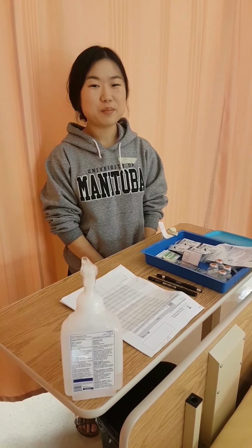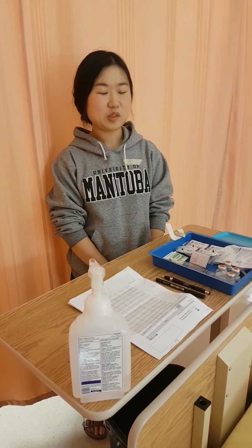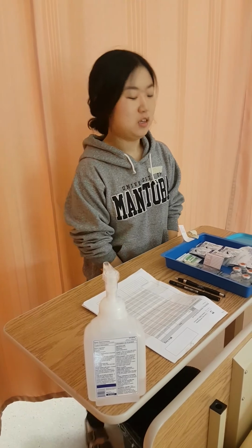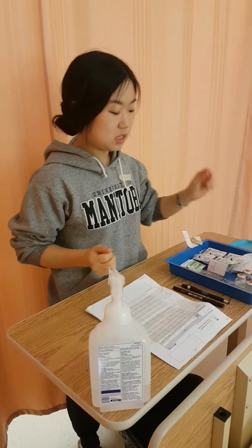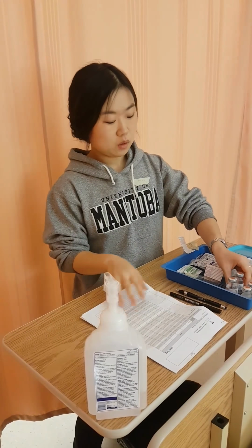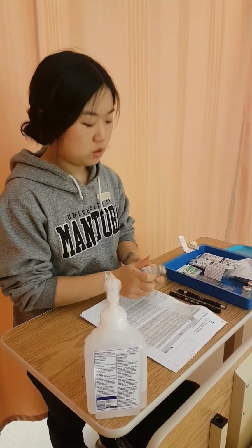Hi, I'm Sol. I'm a third-year nursing student, and I'll be demonstrating how to administer med through IV using a mini bag. So I've gathered all my supplies here, and I picked up my meds from the med supply room, and I have my MAR. So I'll do my first med check.